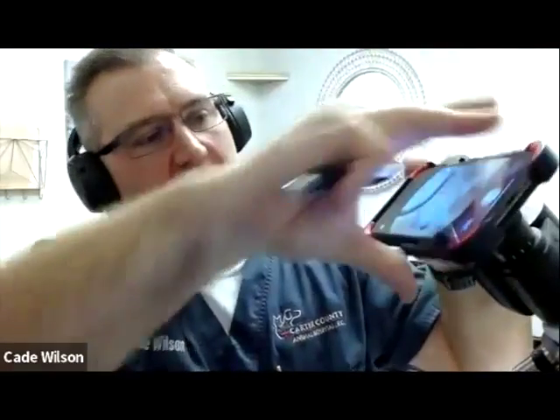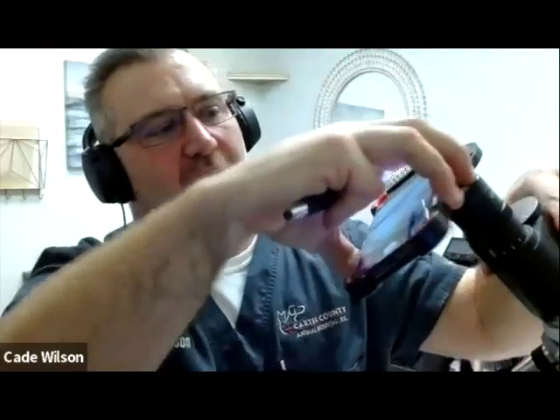I like to do the left side, but it doesn't really matter. I use it because a lot of times we'll do this in landscape, is what I call it. I like to put mine about like that, get it set up. I like to look at mine like that. My brain just likes that better. And so that's why I use that eyepiece. But yeah, just unscrew that little toggle.